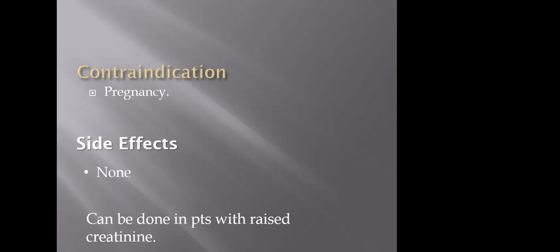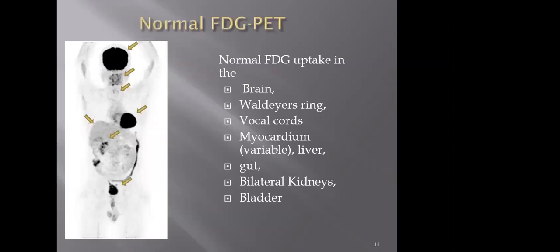If the serum creatinine levels are high, we do a non-contrast PET scan. If it is within range, we can do a contrast PET scan. But there is no contraindication to doing a PET scan if the creatinine is raised. This is the normal biodistribution, which has already been highlighted. Coming to the next slide.